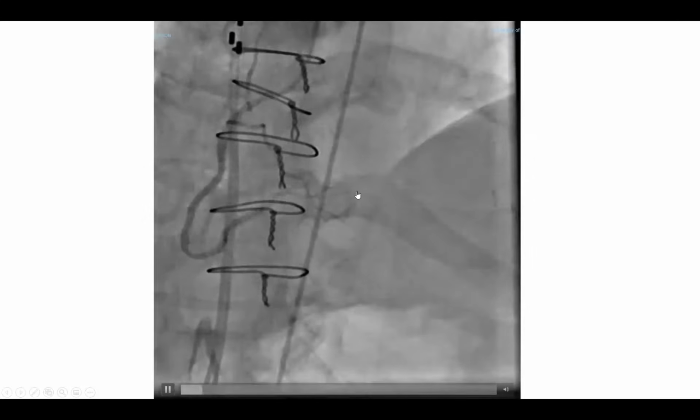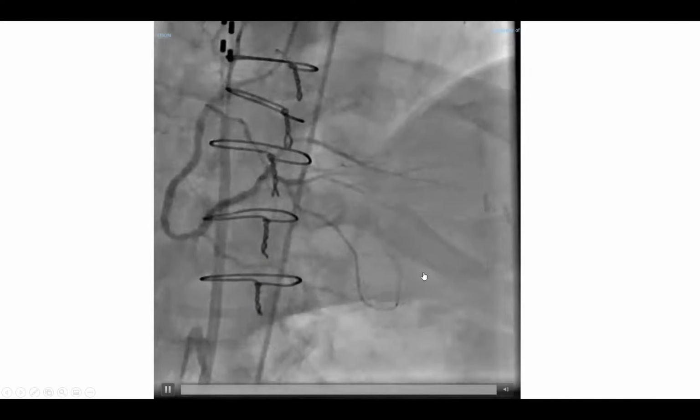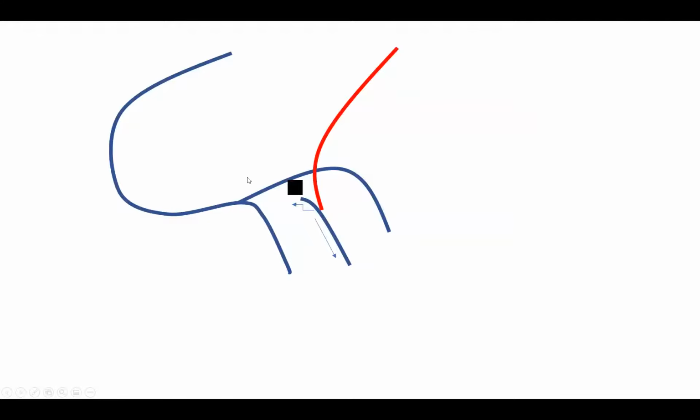Now, if indeed those are bypassed, then you can tell, well, the vein graft to RCA is occluded. But always keep in mind, we probably have another one bigger that is bypassed and that is disconnected from the native RCA. I'll show you this illustration. So most likely what we're seeing here, we're seeing this and this. The true PDA is occluded ostially and it's disconnected from the native right and it's dependent on the graft, okay?